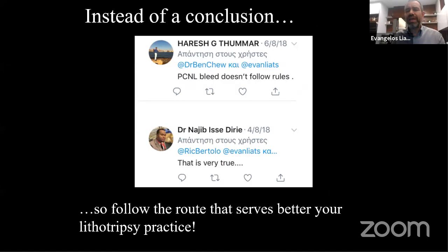And there are certain rules, but clearly bleeding does not follow rules. If that avascular plane of Brödel really existed, then anatrophic nephrolithotomies would have been bloodless, and we wouldn't have any bleeding rates, but that doesn't exist. So this is the only bloodless PCNL that you can actually find. If you can find this, this is really the way to go. Thank you.